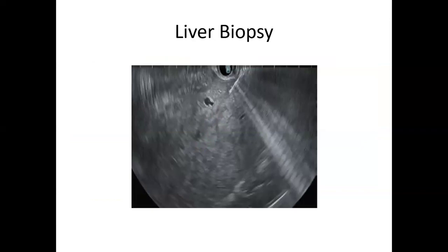This picture is demonstrating how we do a liver biopsy. Light shiny thing we are seeing. First of all, this is our transducer. Then the needle comes at that angle. That's a beauty about endoscopic ultrasound, because you're able to visualize the needle as it is coming out of the scope. And as you are imaging, you're able to see the needle in front of you. And you're able to see, actually, as you are doing procedures, you're even seeing what you are doing.